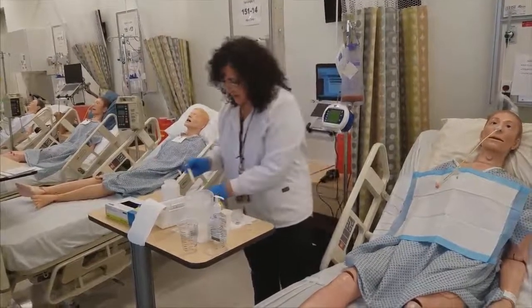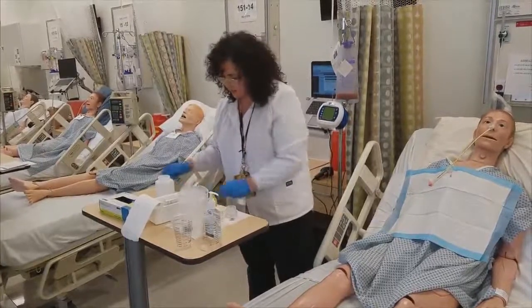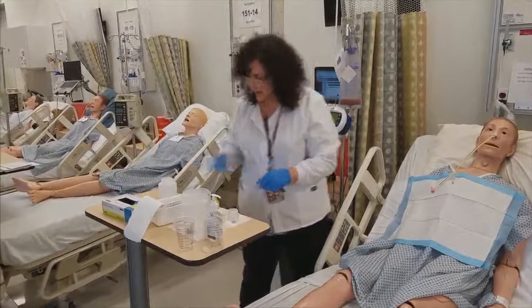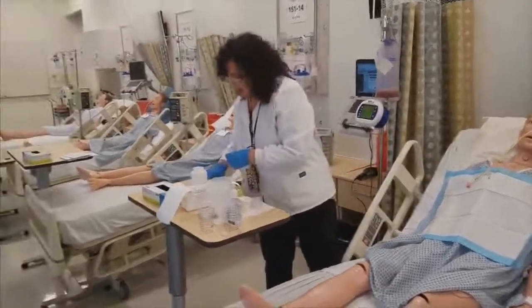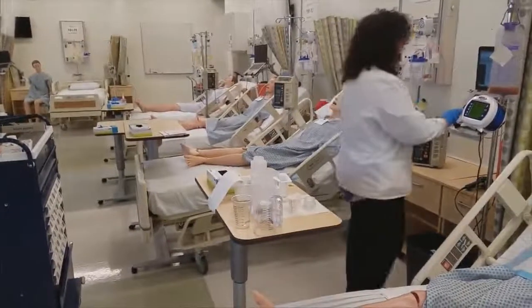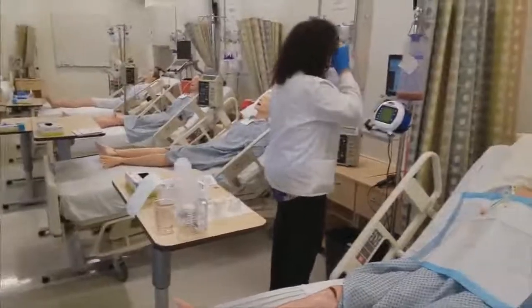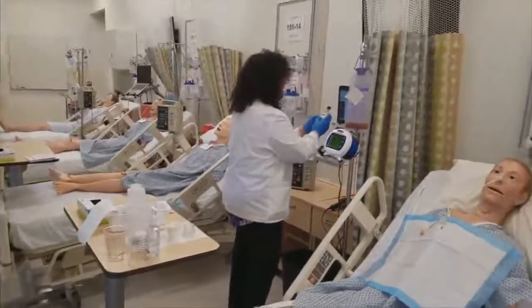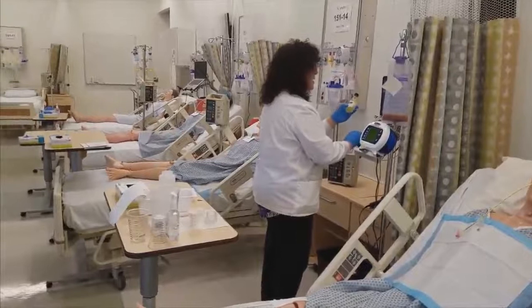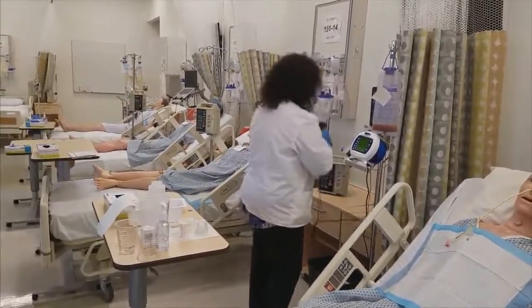Okay, and then I'm going to make sure that this is neatly placed on my overbed table using the wrapper to label it. All right. So the next medication is my lactulose, and I'm going to go ahead and do check number 3 on my lactulose. And then I'm going to scan it in.